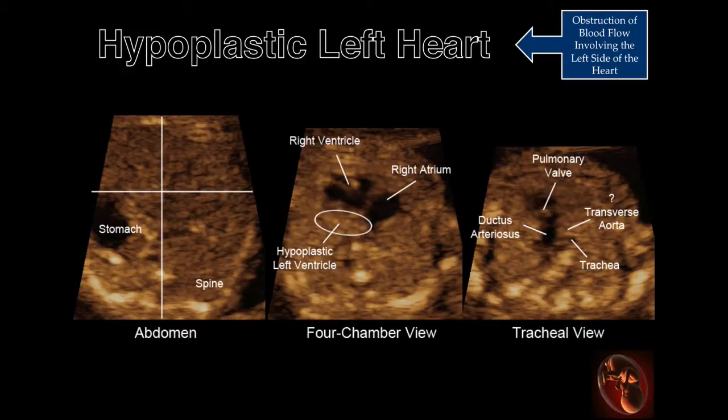The image obtained at the level of the abdomen demonstrates the stomach to be properly placed, thus identifying the left side of the fetus. The four-chamber view demonstrates the hypoplastic left ventricle and atrium with a dilated right atrium and ventricle. The tracheal view demonstrates a large ductus arteriosus with no evidence of the transverse aortic arch.